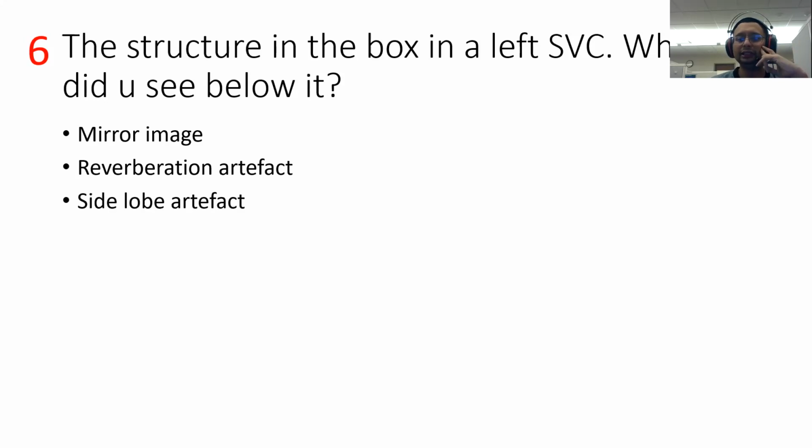In terms of the physics, maybe you need to read up. But this is very important if you want to take the board exam anytime, because they always come out with this kind of question and people always get it wrong because they don't understand. So there are other artifacts called the side lobe artifact and the beam width artifact. Side lobe artifact is where you see an image adjacent but lateral to the other without any reflector.